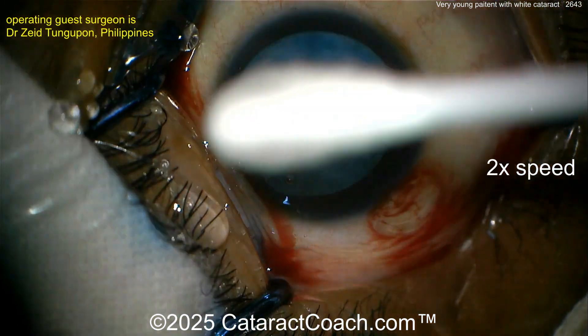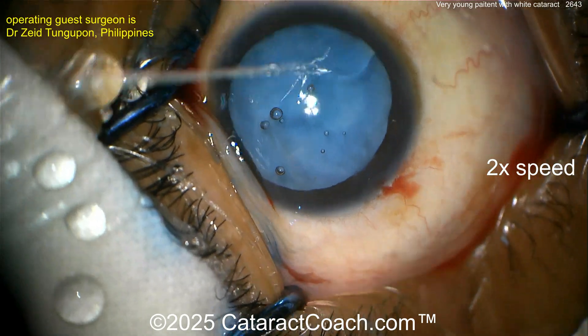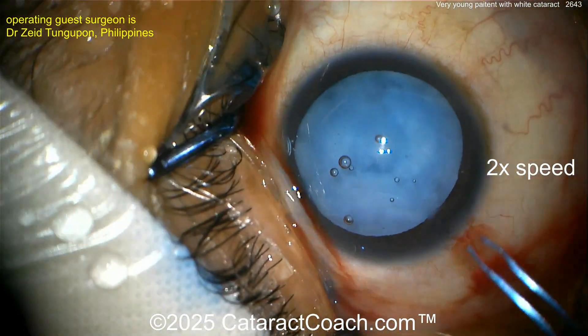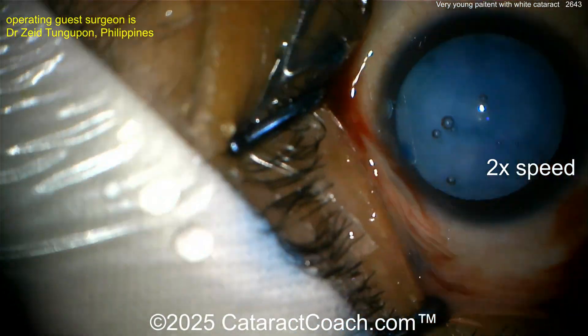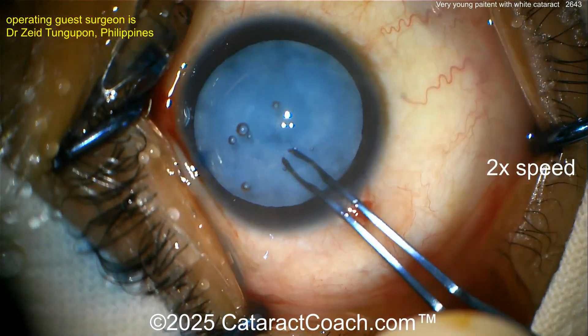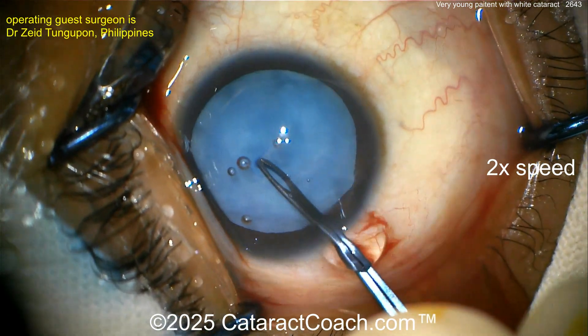Now let's see — we're going to go to forceps perhaps. I don't like to waste any time. I like to get right to it. Forceps going inside the eye here. Because the longer you wait, the higher that risk of Argentinian flag sign is. You grab the capsule — looks good.